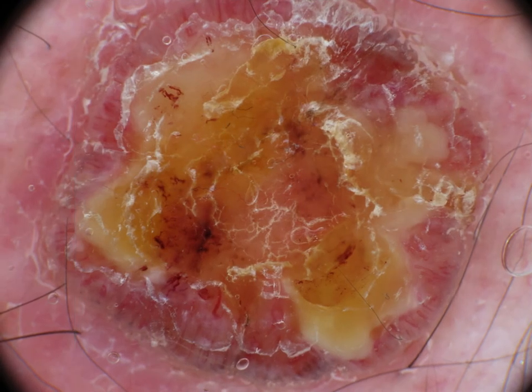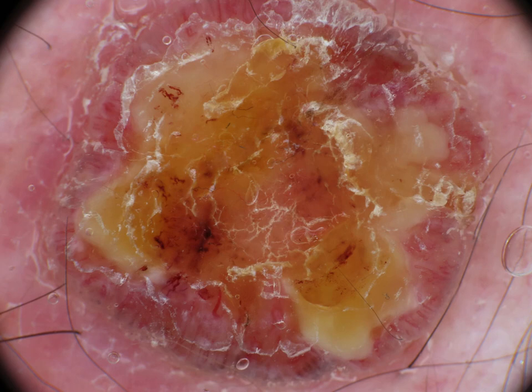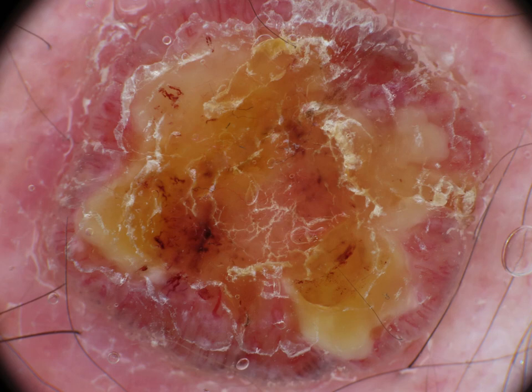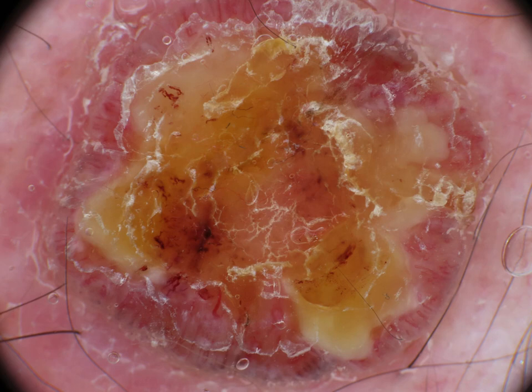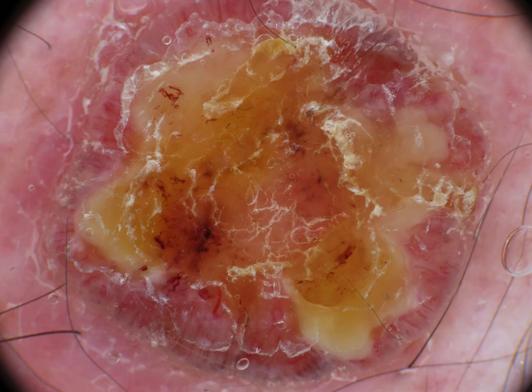Speaking purely about vessel morphology, we see linear hairpin vessels at the edge of this raised tumor. We see some white color and a centrally located yellowish mass. If we think only about vessel morphology and the central part of the tumor, our diagnosis would be squamous cell carcinoma.